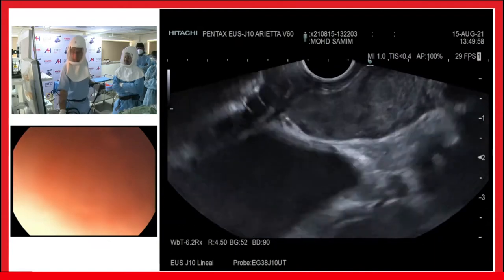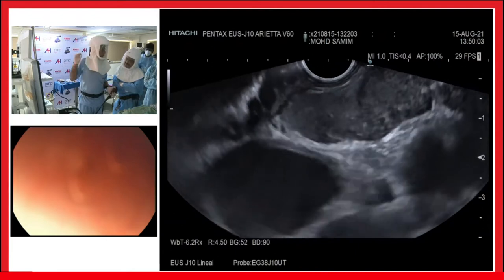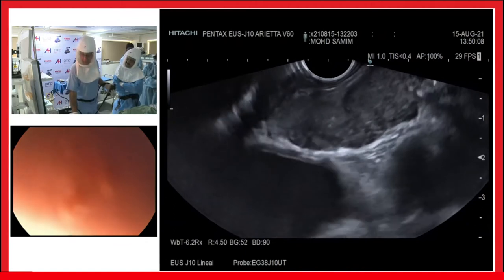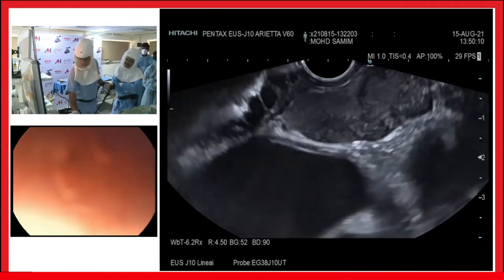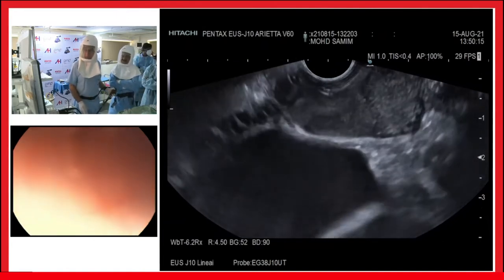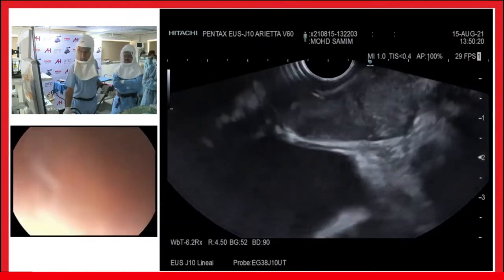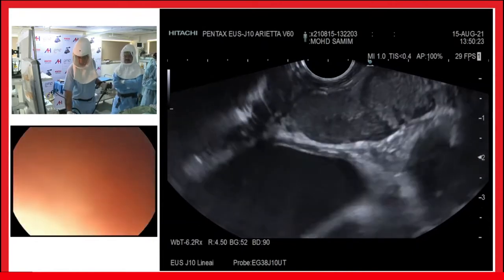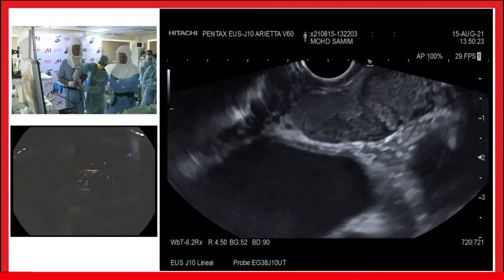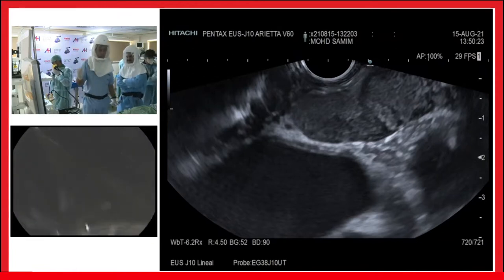Now, just for a sec, because I have not demonstrated the lymph nodal characteristics, others have, I would like to demonstrate them by briefly recording the video and then taking the FNAC out. So this is a brief video I am recording, and I will show you the lymph nodal characteristics of this patient. Please change the scope, change the patient. In the meantime, I will analyze and show you the lymph nodal characteristics.